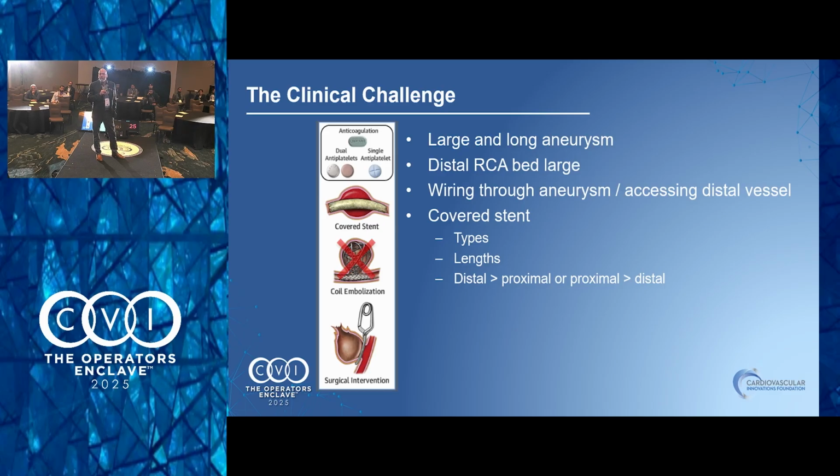I would go distal to proximal, like normally. At least have half of the stent in the vessel distally, and then you have the hanging half, and then you just stack them up. But yeah, with the length, it's an issue.